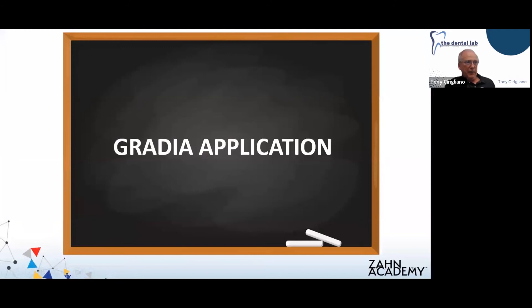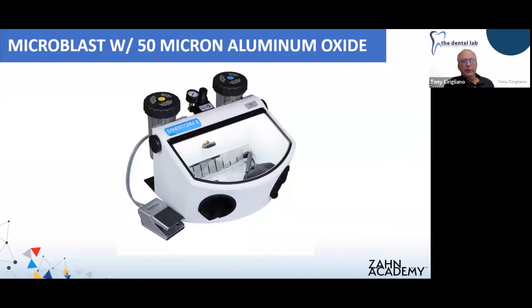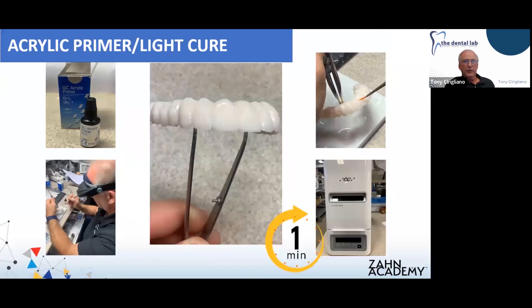As we get into the application of Gradia, we're using GC Gradia material to characterize and apply the soft tissue to our bridge. One thing that's very important: any area that is going to receive Gradia or characterization, you want to sandblast it with 50-micron aluminum oxide, clean it very well and dry it very well. Any area receiving characterization, you're going to apply the GC acrylic primer to those areas — one even coat is all it really takes — and light cure it in the Lab-A-Lite for one minute.